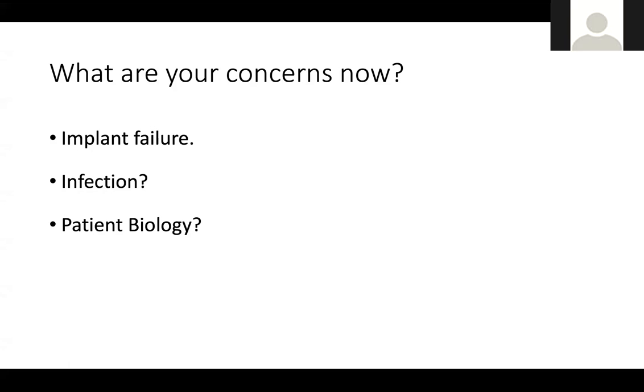All right. So the argument is that when you are completely not weight bearing, you are going to have a joint reaction force of about 3 times the body weight, just because of the pull of the abductors trying to carry that joint. So that force is transmitted across the femur. You still have a significant amount of force being transmitted across your fracture fixation. It's not that the hardware is not carrying weight. It's actually carrying more than the body weight.